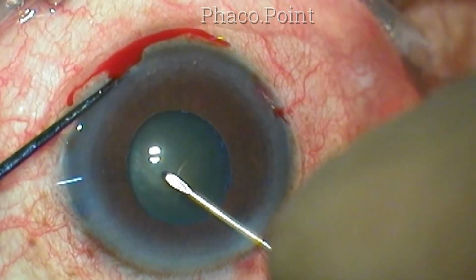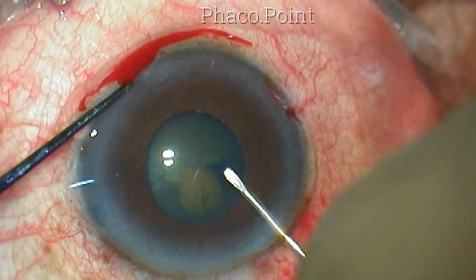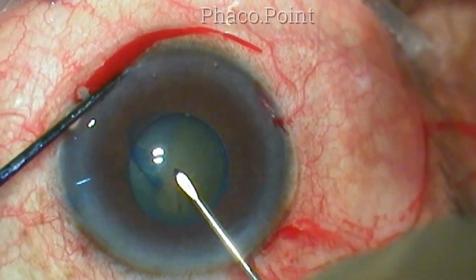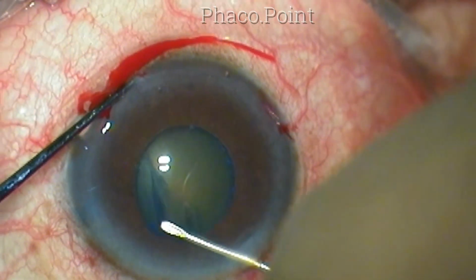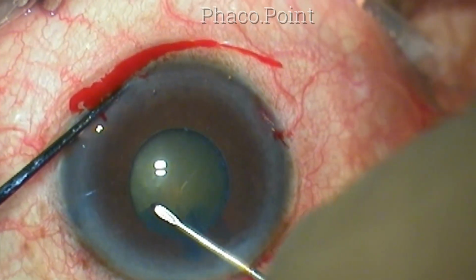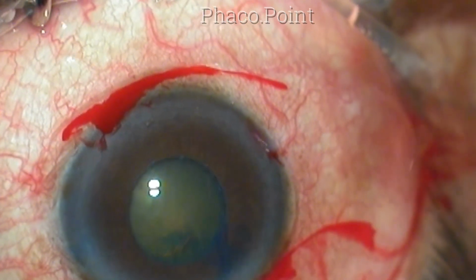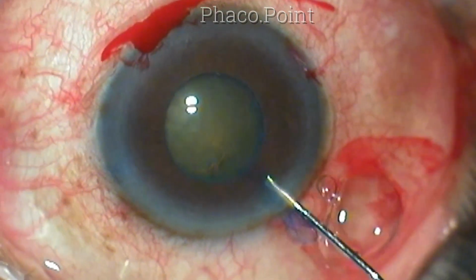From this stage on, the video is totally unedited and you can watch the video unfold as it happened on the operating table. I try to keep the capsulorhexis as large as possible and I'm able to create a pupil hugging capsulorhexis. The reason why I'm taking my time with the rhexis is to see if there are abnormal folds that occur while performing the capsulorhexis, which will give me an indication and a clue that there is some amount of zonular weakness. I did not see any such sign of zonular weakness.